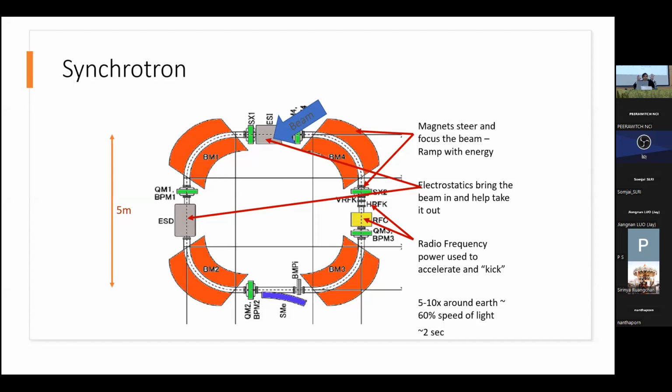The magnets all change their magnetic field, and the accelerator changes its frequency a bit upward, and then the beam comes back around, each time faster, faster, faster, so they get more and more energy. Hence the synchrotron. Both the magnetic field and the RF are synchronized together to keep things moving, and they go around until you extract them.